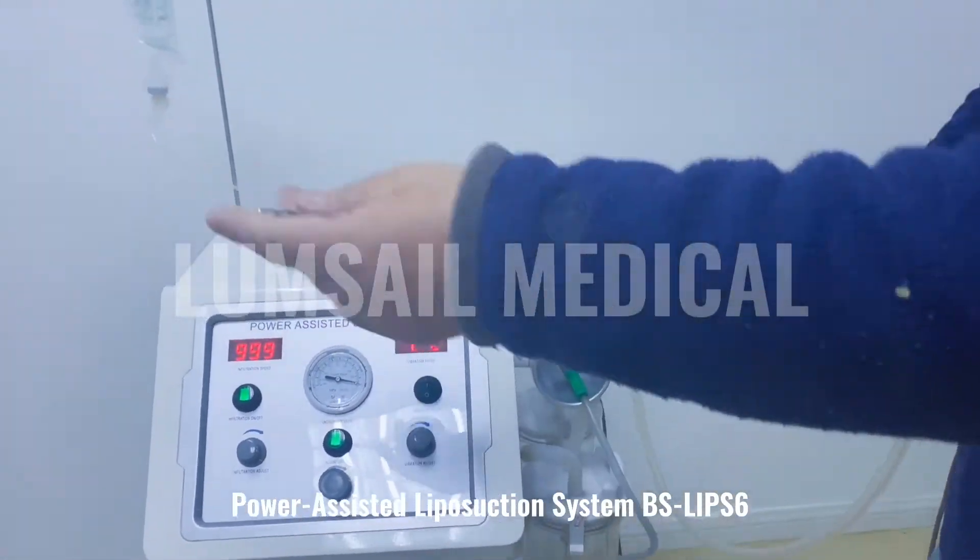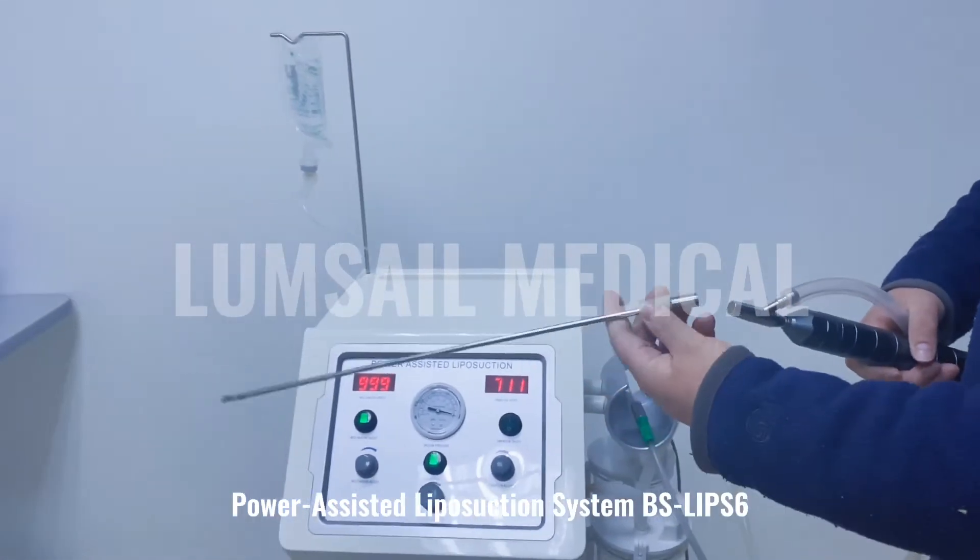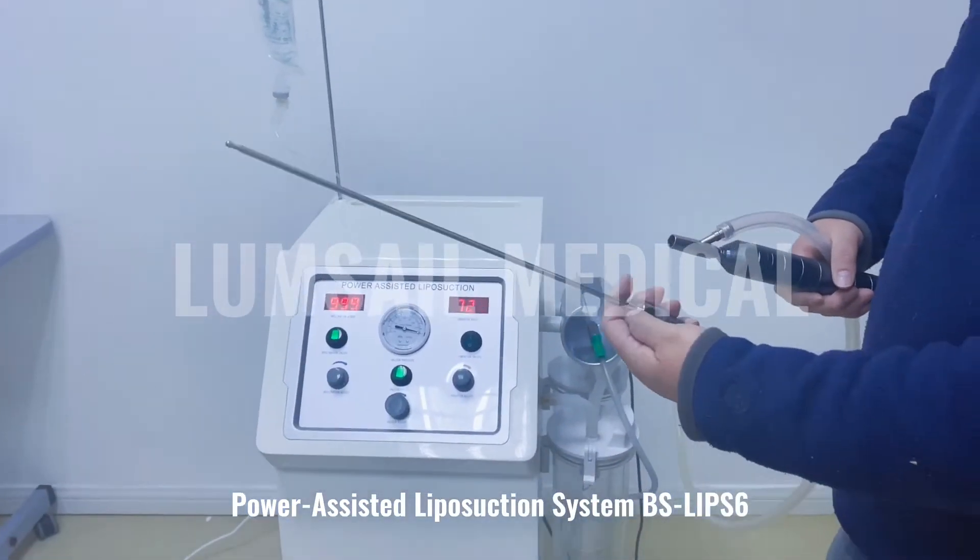This is the cannula. It is very easy to exchange the cannula. We provide a set of cannulas in different sizes and dimensions.